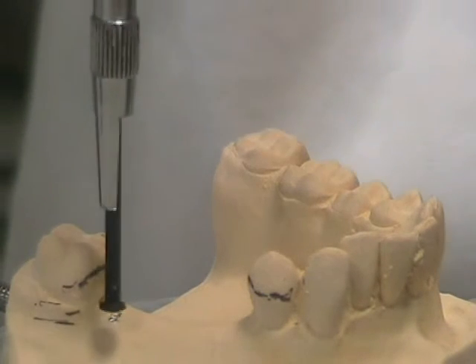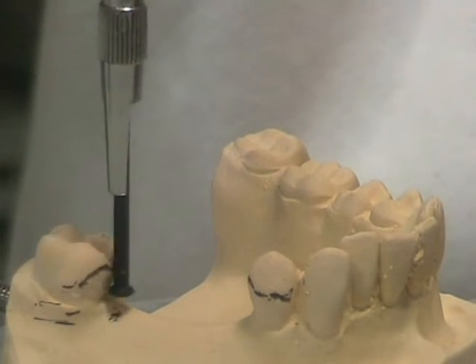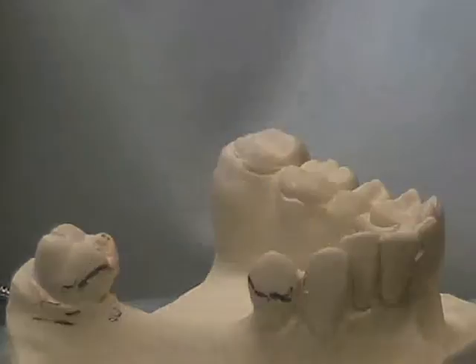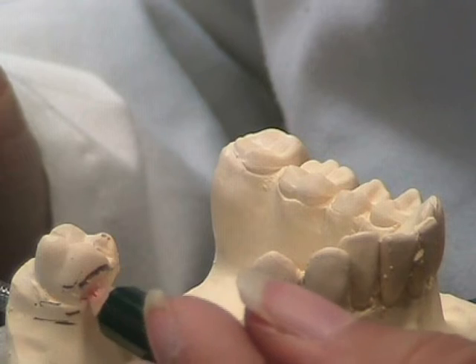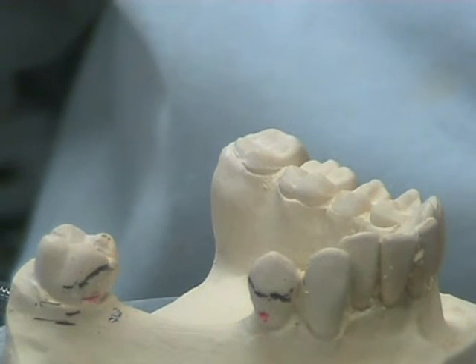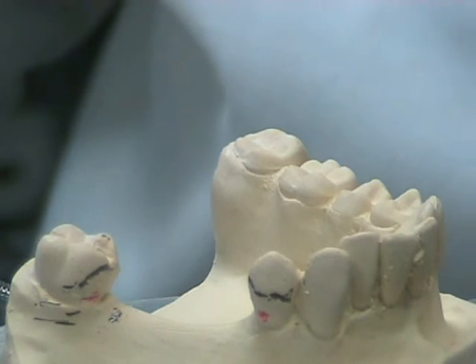This is repeated on the other tooth as well. In order to record this, a mark can be made. This point is the position where the tip of the clasp will seat. It is only at this point that the clasp engages the undercut.